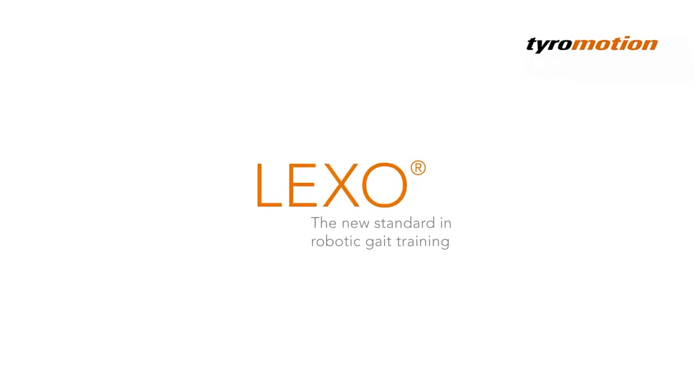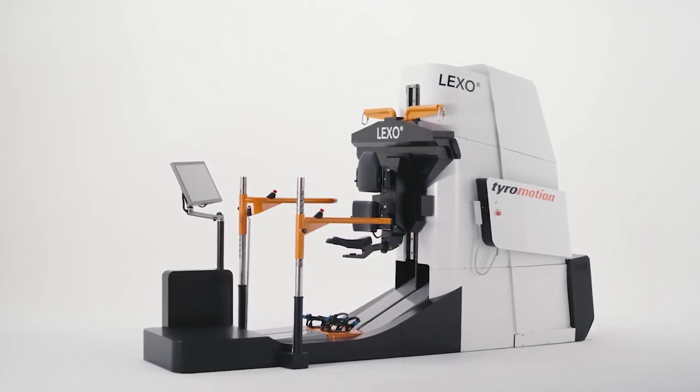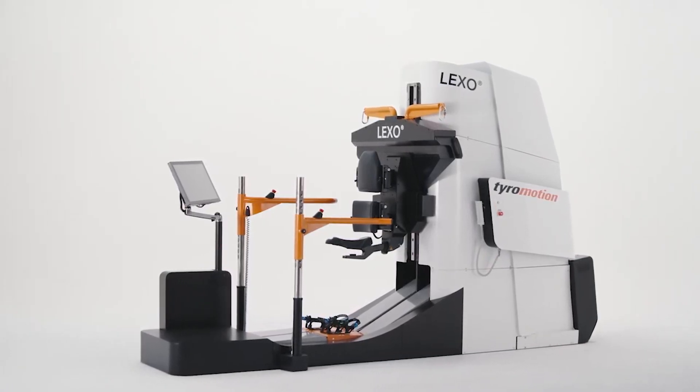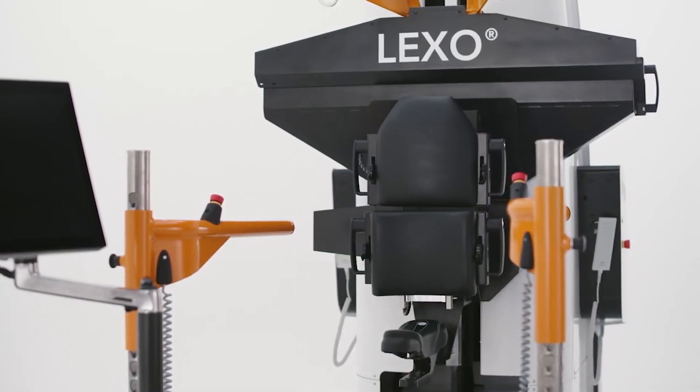Lexo is a game-changing robotic therapy device for the lower extremities that offers a new standard in gait therapy. The device promotes therapy progress by boosting patients' net therapy time with its fast and easy setup.